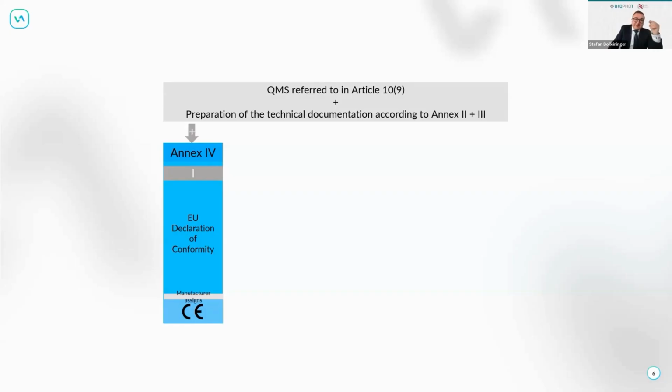That's why I came with the standards first. The standards do not have any discretion between whether it's a class 1 medical device, a class 2A, a class 2B, or a class 3 medical device. They always have the same structured setup and the same outcome, and they mandate the same documentation. There will be one additional setup, and I will explain that later, where we have a different solution or a different outcome about the software risks. However, based on the overall setup, it will always be the same part.